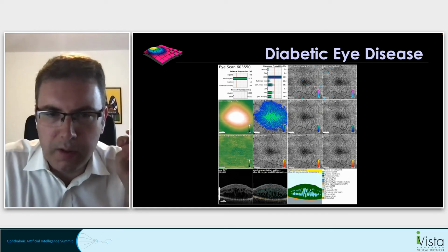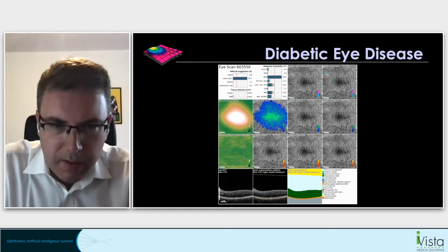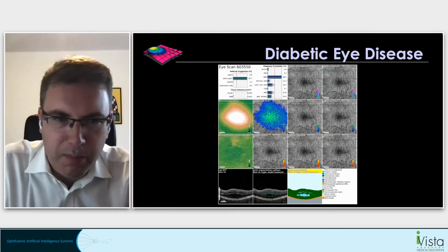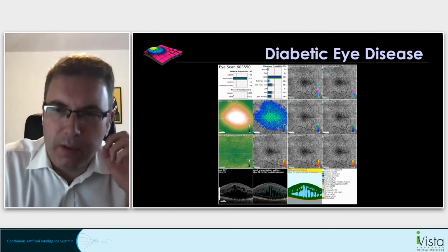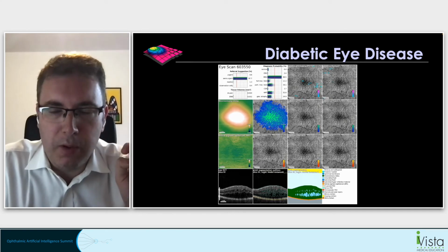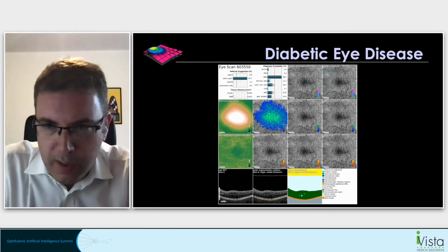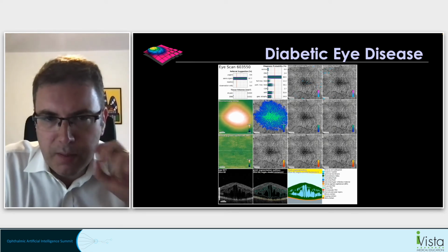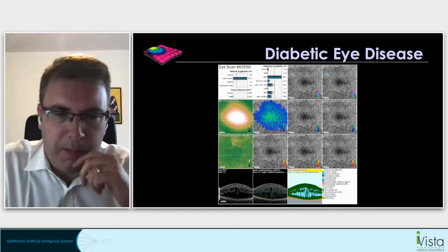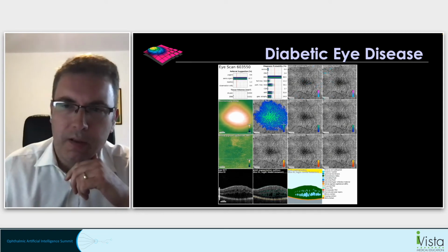On the second row, it gives a heat map. In this case, it's showing an intraretinal fluid map. And on the top left, we can see the outputs of a second neural network, which is a classification network. This gives a triage decision. So it says, in this case, semi-urgent referral to a retina specialist, and it gives a diagnosis probability, in this case, saying macular retinal edema.